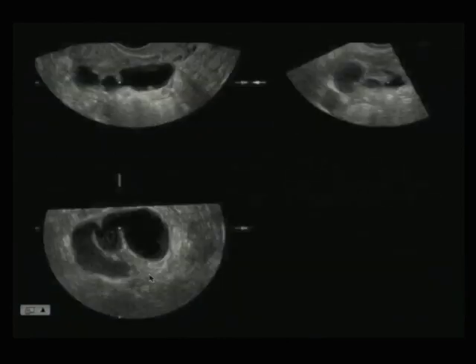Now, 3D ultrasound is also very useful in the adnexa. Here's an example in the adnexa of cystic areas that certainly look like ovarian cysts. Wasn't really sure what they were. They were ill-defined, certainly non-specific in their appearance. But in fact, if you then reconstruct the plane that you can't scan in, you will immediately see that this is a hydrosalpinx.